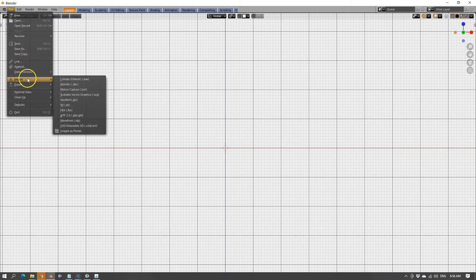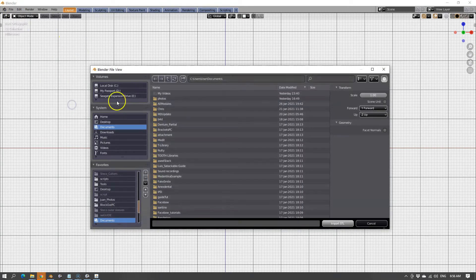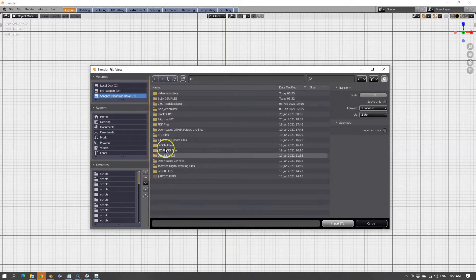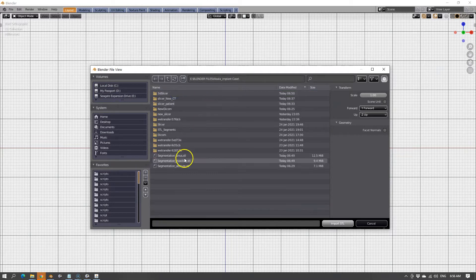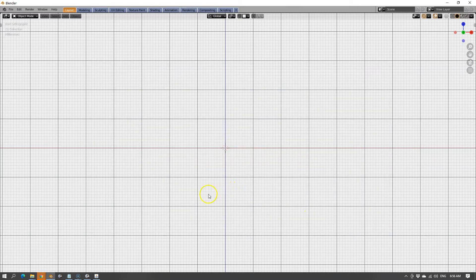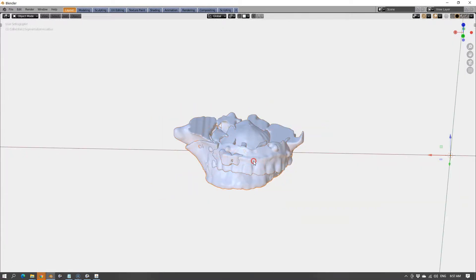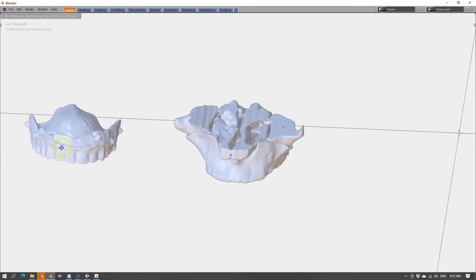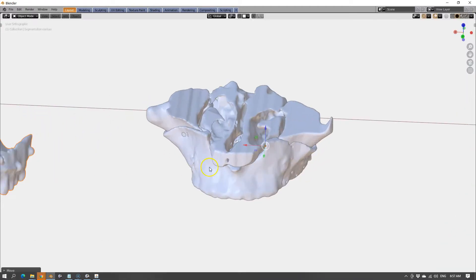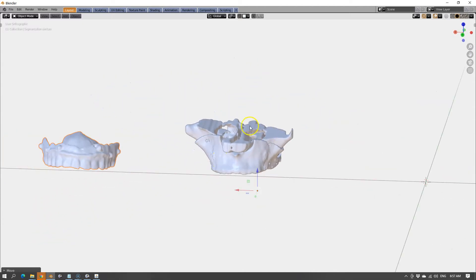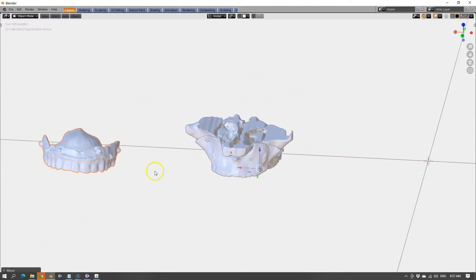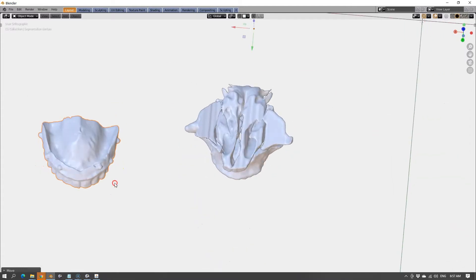File, import STL: sinus, maxilla, and denture. The denture we're going to move aside. And then we're going to do some object management. We're also going to bring in the actual scanned patient's denture. We can do that as well.